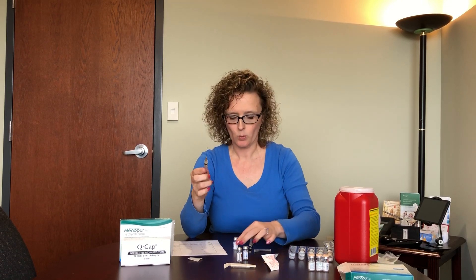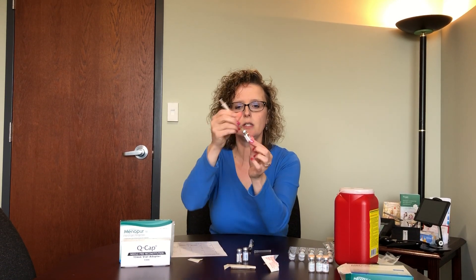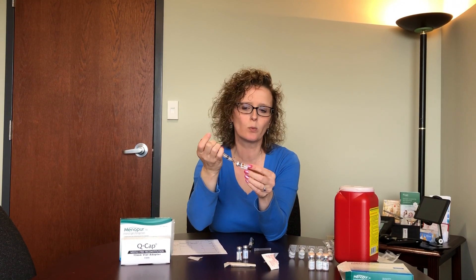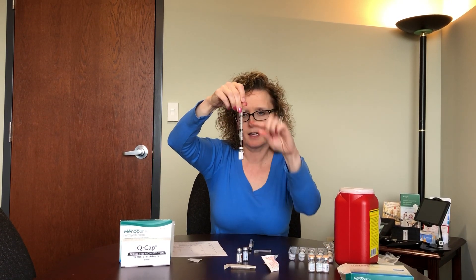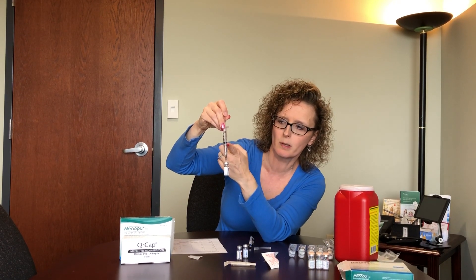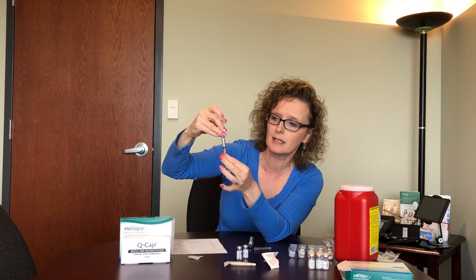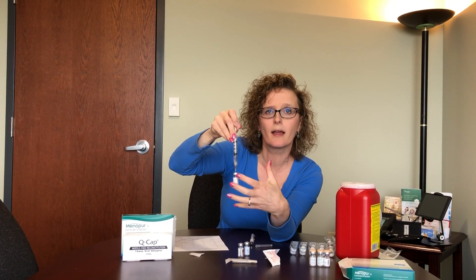Pull the cap straight off — and as promised, there's a nice big needle in there. Stick it in the center of the gray piece on the saline vial. This holds two mls of saline, but we only need one, so pull up on the plunger — you can see it lifting the liquid into the syringe. You want the top of the liquid to be at the one-ml line; these are numbered nicely with lines so you can always tell how much you have.